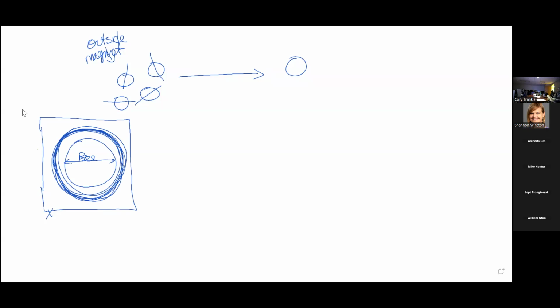So there's lots of copper, about $600,000 worth, wrapped around. And what happens is when that magnet is put in, there's an electric charge put into that, right? And then wrapping the wire in this space is helium.